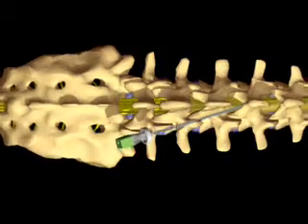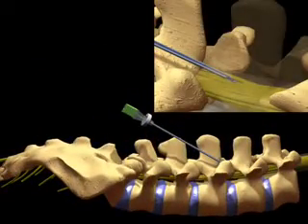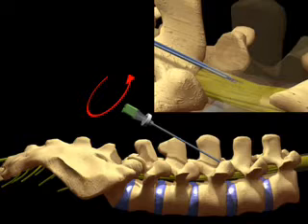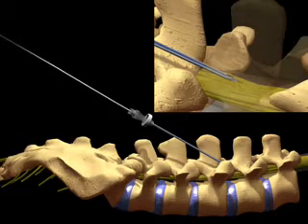The needle stylet should be kept in place during dural puncture with the beveled needle tip oriented parallel to the longitudinal dural fibers. A return of cerebrospinal fluid through the needle, even with the stylet in place, signals entry into the intrathecal space. With paramedian oblique needle placement, a minimal bend in the catheter eases guide wire removal and decreases the chance that the catheter will be damaged or kinked at or near the entry site in the lumbodorsal fascia.